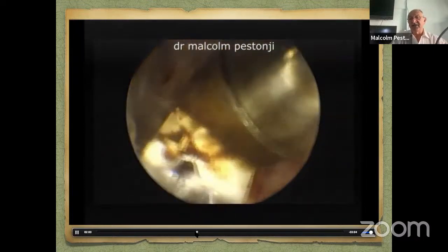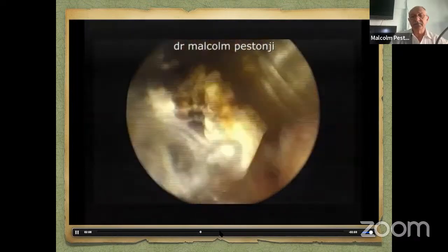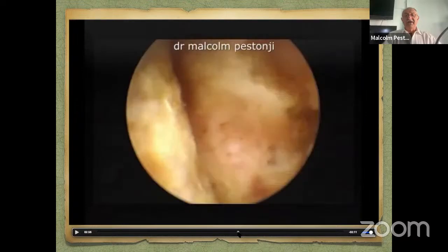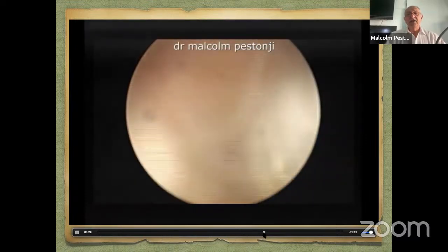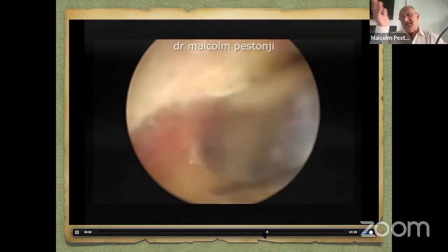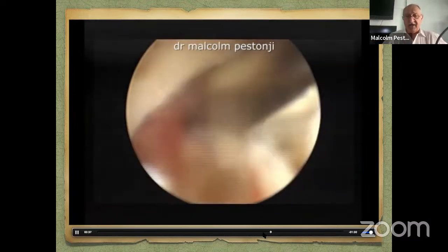Here I'm clearing at the base of the spinous process, the surface of the lamina. So we have established our first landmarks. Now eventually the flavum starts coming into your view. Here we are in. After using a burr, as this is a case of stenosis, at the base of the spinous process, cutting it so that I can go on to the contralateral side.